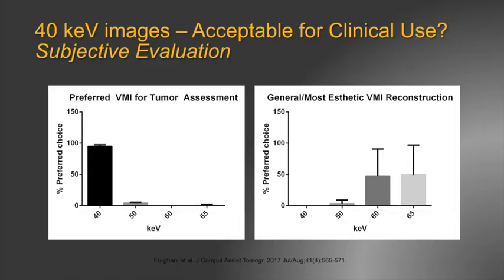Now, I alluded to subjective acceptance of low energy VMIs, which was especially an issue with the earlier versions of dual energy CT scanners. We actually performed a study formally evaluating this, consisting of multiple radiologist evaluations that included head and neck imaging experts as well as general radiologists.